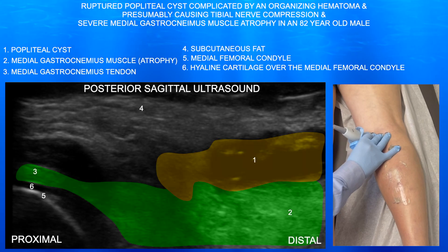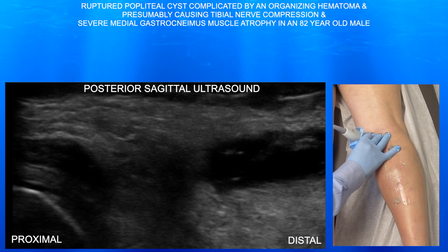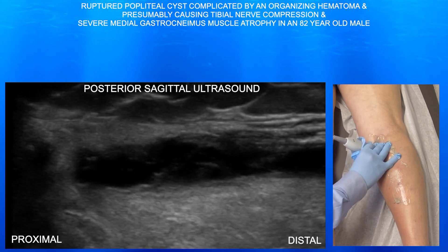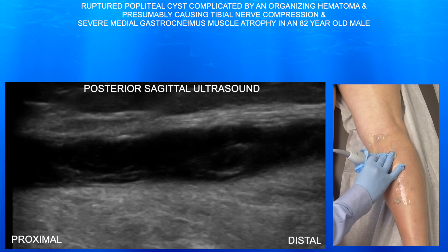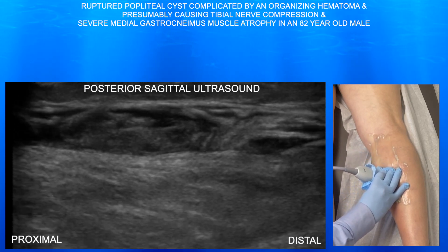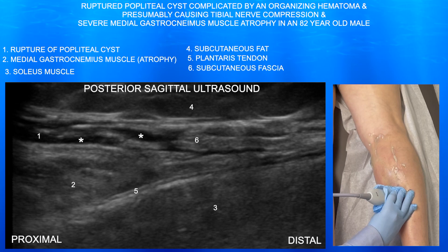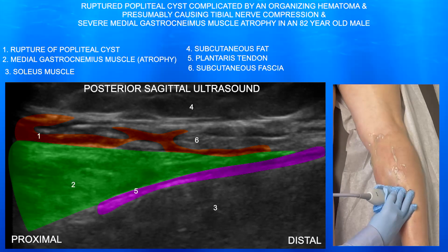Here we are looking at the proximal aspect of the cyst in addition to the proximal aspect of the medial gastrocnemius muscle. You can also see the medial gastrocnemius tendon overlying the posterior aspect of the medial femoral condyle. Here we're going distally, and you can see the extent of this rupture and the extent of this cyst. Here you can see some of the fluid again within the subcutaneous fascia, which is just superficial to the medial gastrocnemius muscle.